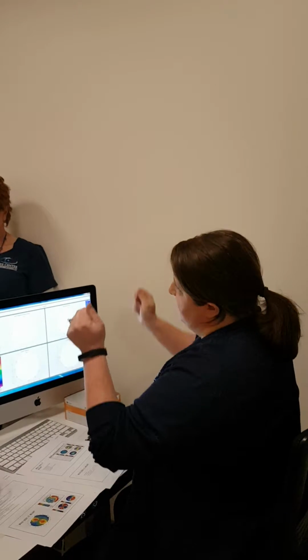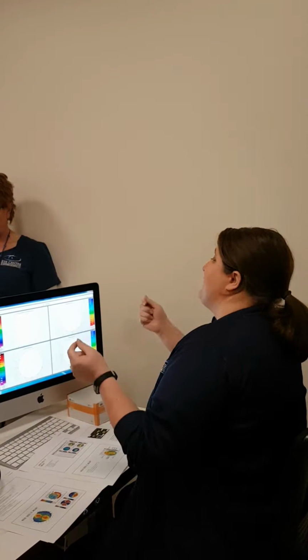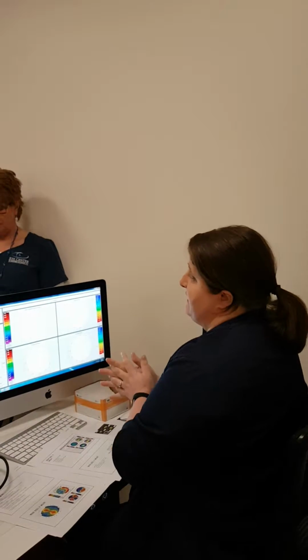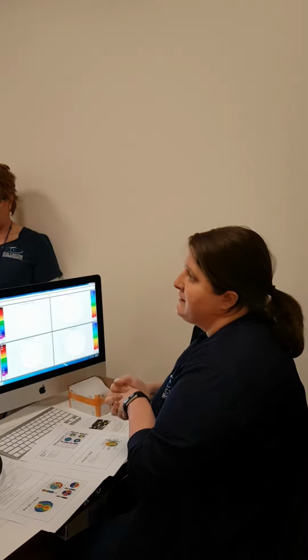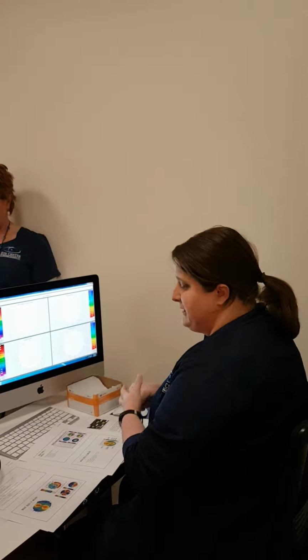Oh, it's moved, I can move these 2 sutures. Or, I don't have any more sutures left to remove in that particular area. We're going to leave it as it is, okay? And then the patient will just need glasses, contacts probably, after their surgery for best corrected vision. So super important for those PKP patients.